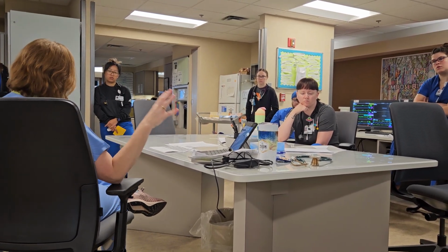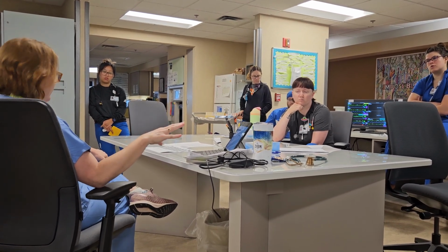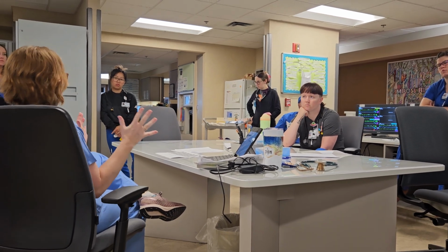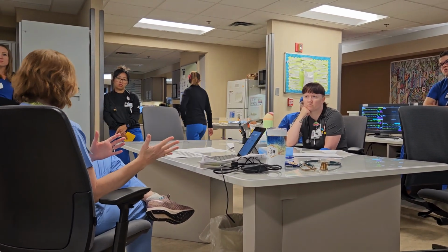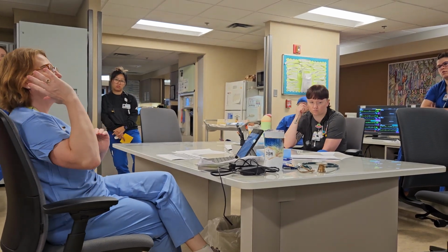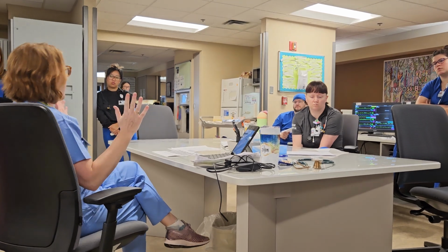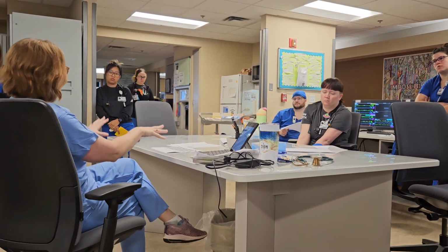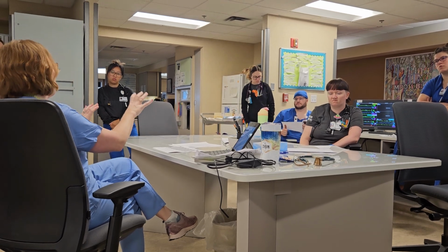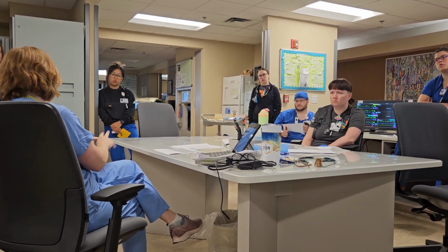Adjusting respiratory rate or tidal volume will not affect your oxygen. It affects the carbon dioxide, which we refer to as ventilation. So when we say we have a hard time ventilating somebody, that's not an oxygenation issue. When we talk about ventilation, we talk about their ability to clear the carbon dioxide. So think of that when you're interpreting your ABGs or your VBGs in the morning and deciding, well, this person is hypercapnic, what would I adjust? You would be looking at adjusting respiratory rate or tidal volume.